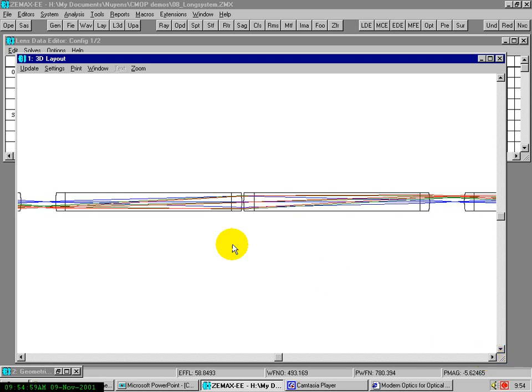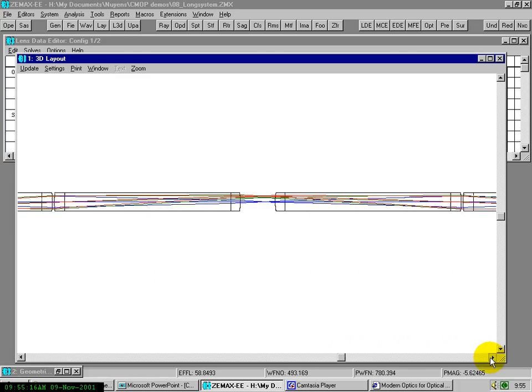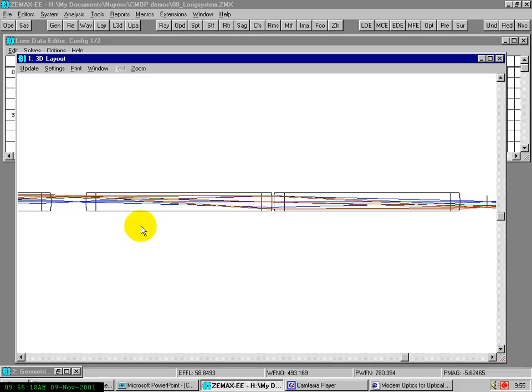Okay, this is repeated from here to here, and again here we see the principal rays passing through the optical axis. So here we have again an image of the stop, the aperture stop. And finally we have the last relay stage from here to here, and again here we have an image of the aperture stop.